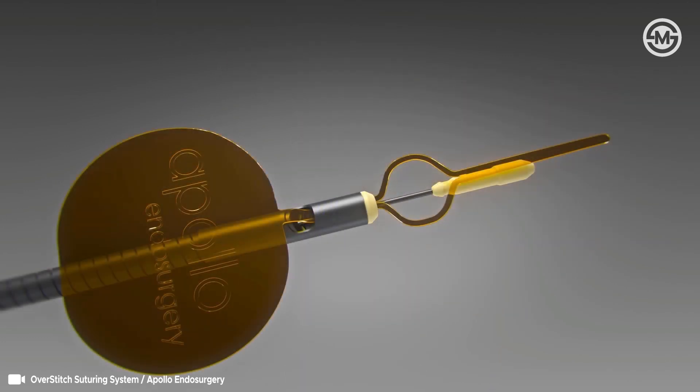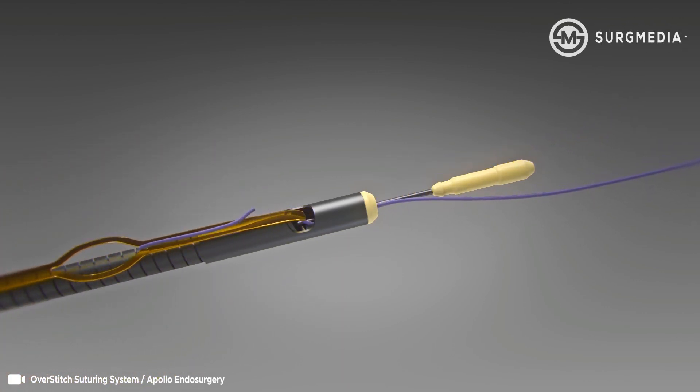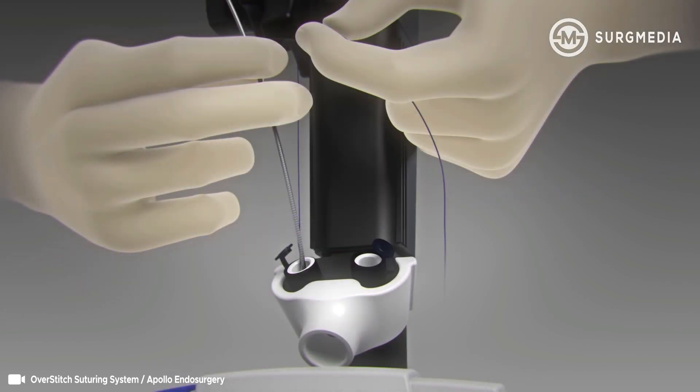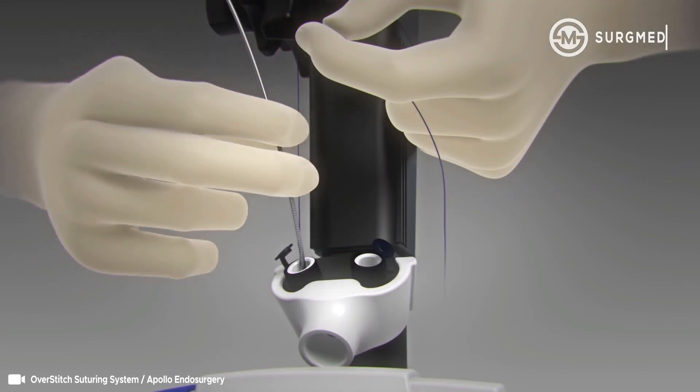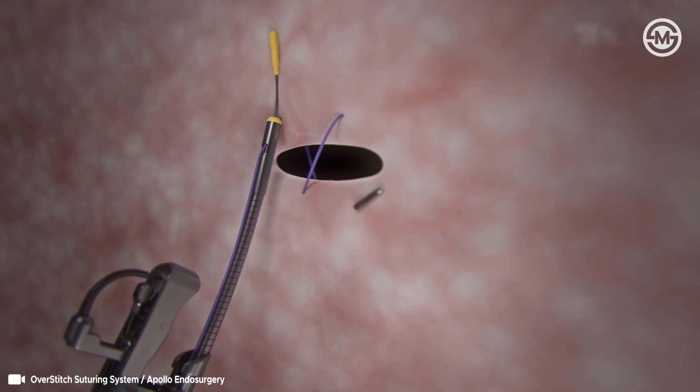To load the cinch, thread approximately three centimeters of the distal end of the suture through the gold suture loading loop. Pull the gold tab in line with the catheter until the suture has passed through the peak collar. While holding slight suture tension, insert the cinch into the 3.7 millimeter channel of the scope. Advance the cinch catheter until it extends approximately three centimeters past the overstitch end cap, targeting the placement of the first bite.